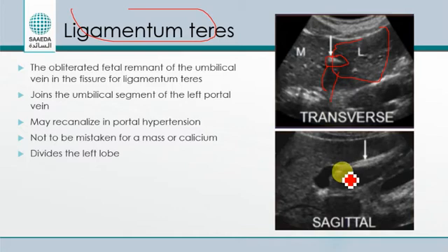Okay? In the sagittal images, you can see this is the left portal vein, and this is the ligamentum teres joining the left portal vein.